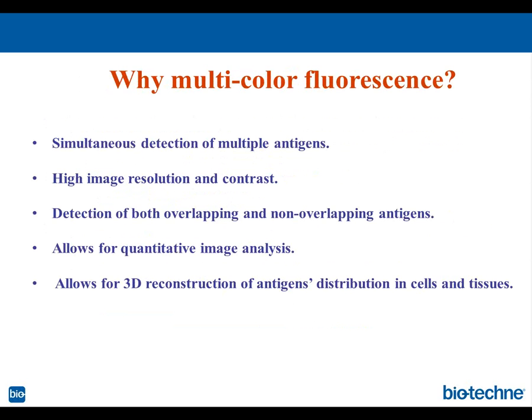And lastly, I would like to mention that immunofluorescence is an incredibly good tool for doing three-dimensional reconstruction of the distribution of antigens in cells and tissues. There is no other technique allowing us to do this. And again, we're back to square one. What if we are stuck with antibodies raised in the same host species?